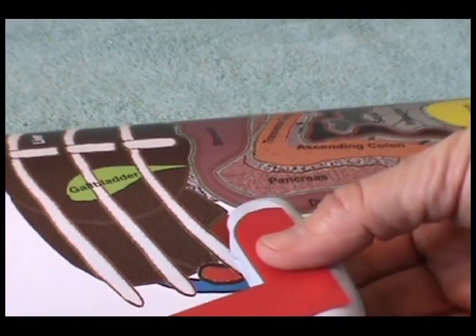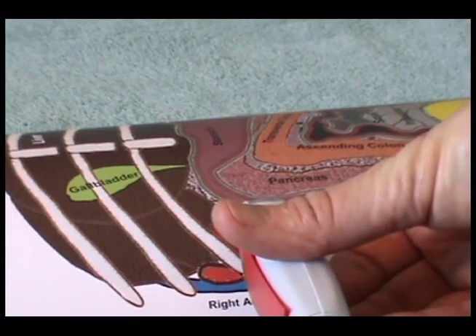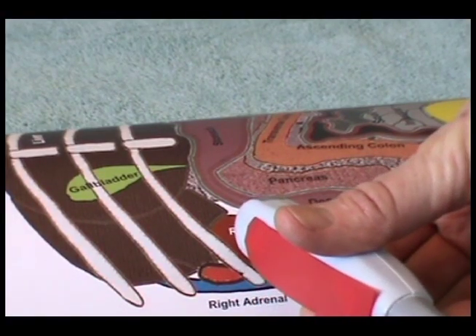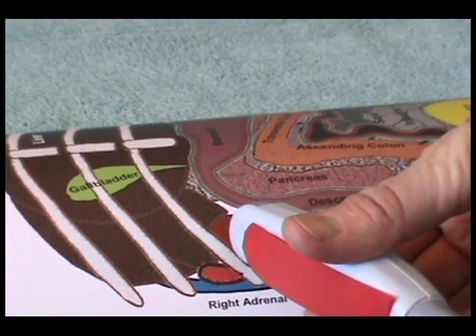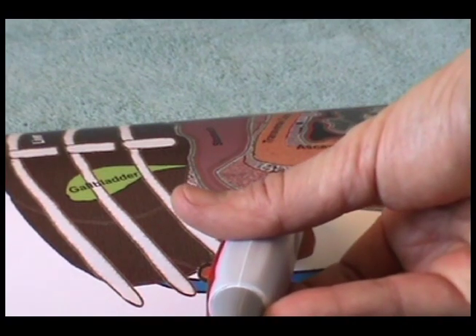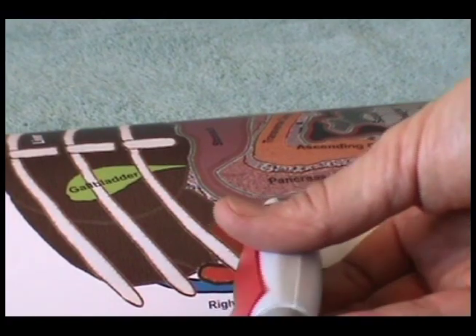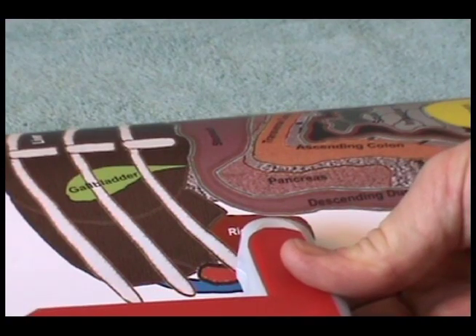Rotate the transducer 90 degrees counterclockwise to a transverse position and fan cranially till the transducer no longer points at the kidney. Then reverse directions and fan caudally till the transducer no longer points at the kidney. Rotate the transducer 90 degrees clockwise back to a right lateral sagittal position.